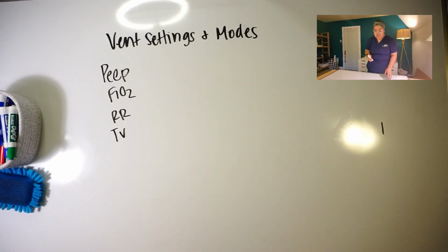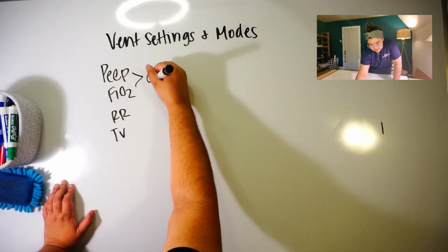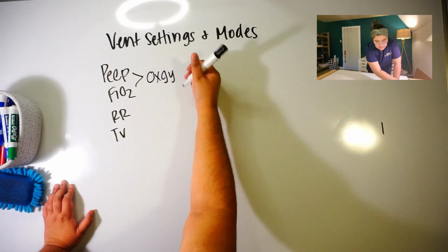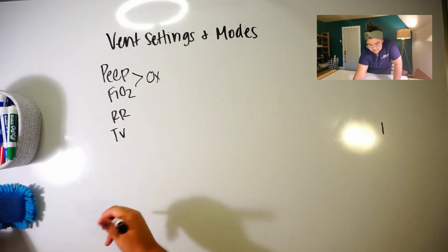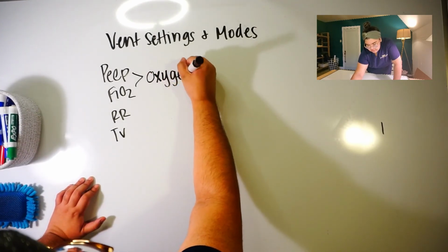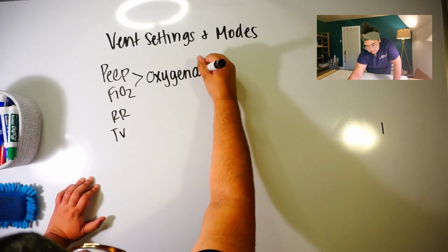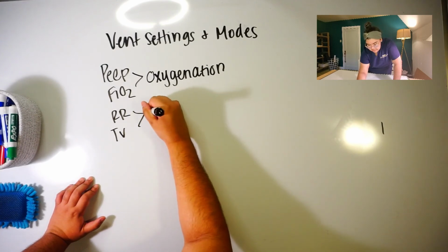So these two, PEEP and FiO2, will affect oxygenation. I can't even spell oxygen, but I just woke up. And these two are going to affect ventilation.